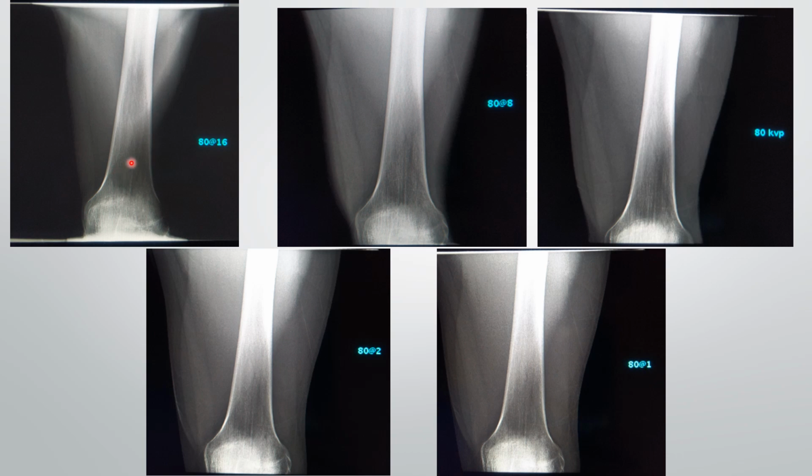I would say clearly, once we get to this point, the quantity of the x-rays that we are producing is so great for this tissue that with the penetration, so much is reaching the IR that it's representing all this area as black, okay? And we can't see any details in here, all right, because it's just blackening it all out, and it's even working to the thicker part of the leg up here, right?